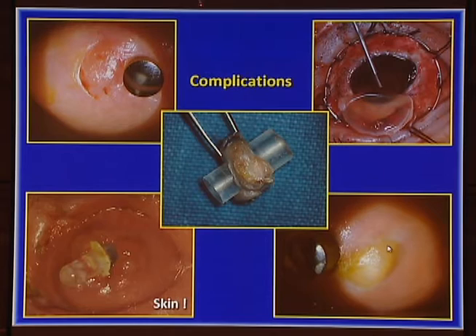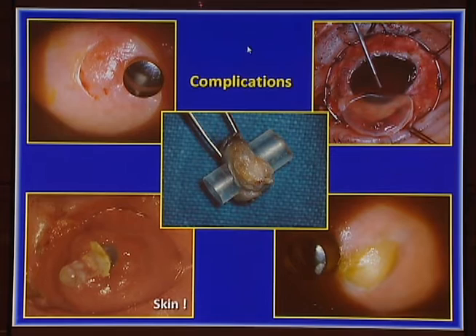I remember the first case, which was done in Miami with Dr. Victor Perez. The result was excellent. The patient didn't go back for follow-up, and she lost the eye because she turned to Dr. Perez when the lamina was nearly expelled. So that was a pity.